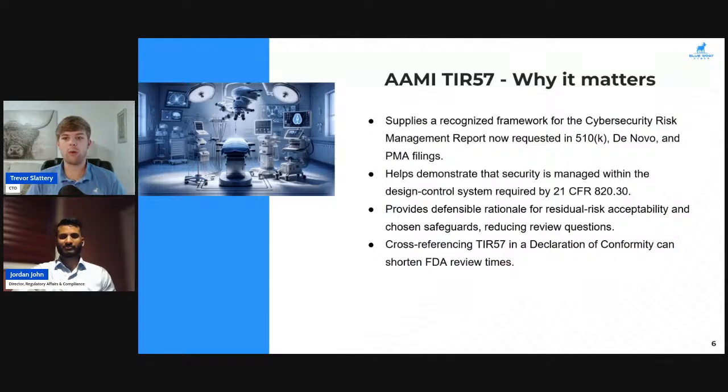If we're just providing risk to the FDA and saying, we think this is acceptable, they're going to come back requesting some justification. Now, if we're cross-referencing TIR57, this is what the FDA treats as their gold standard. It's a good look to have it as part of your submission materials, in other words.